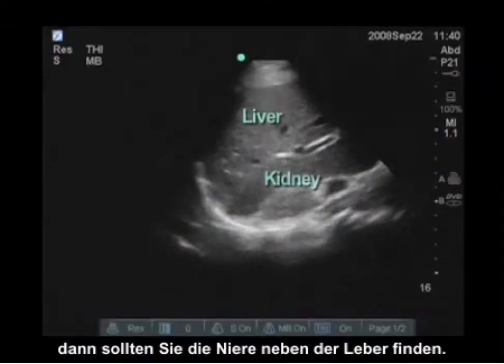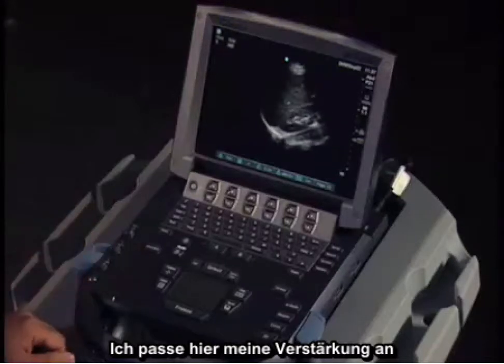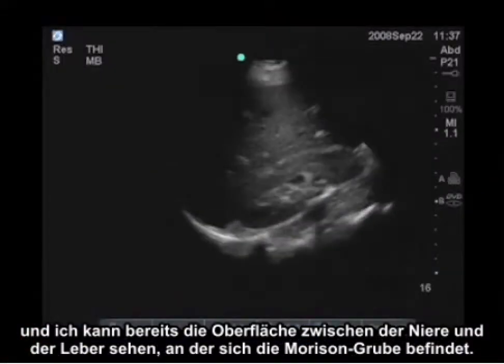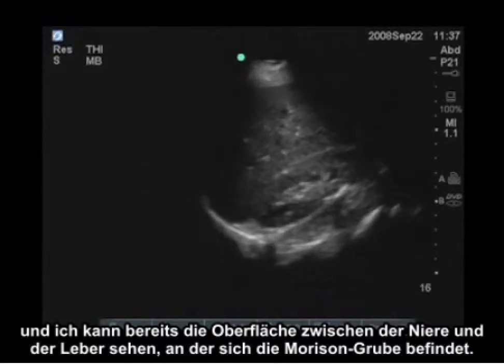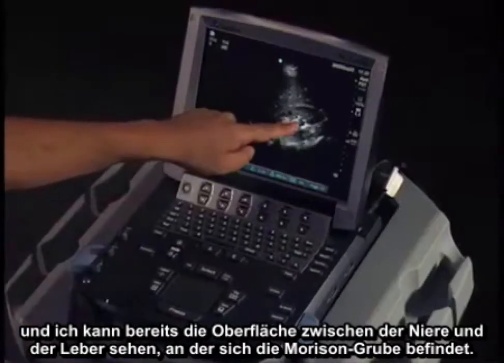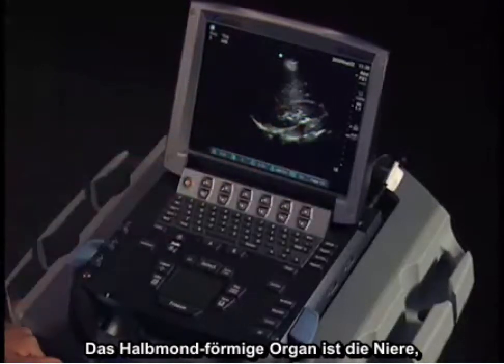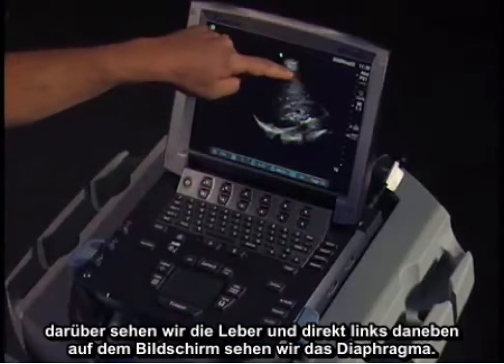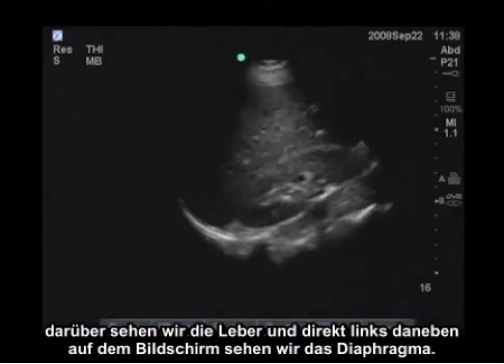You should be able to find the kidney and see the adjacent liver. I'm adjusting my gain here, and already I can see the interface between the kidney and the liver, which is Morrison's pouch. On the bottom we see the crescent-shaped kidney, above it the liver, and to the left side of the screen we see the diaphragm.